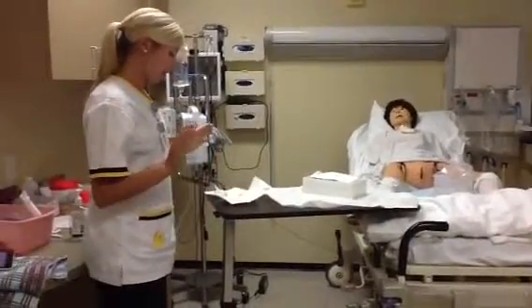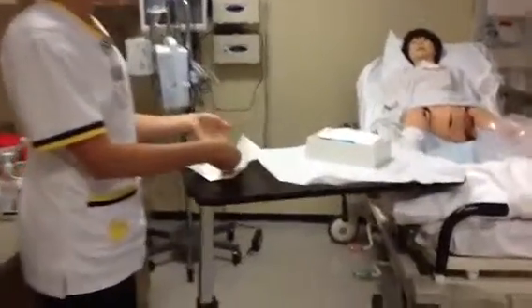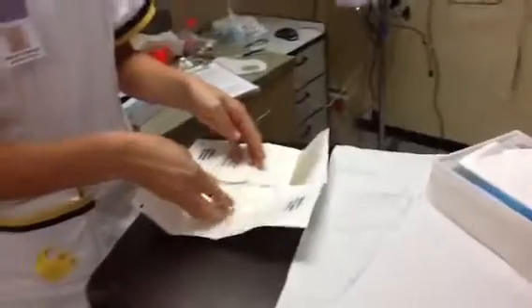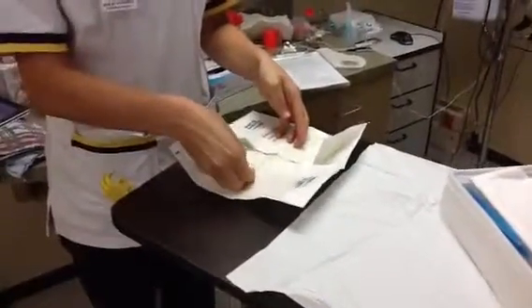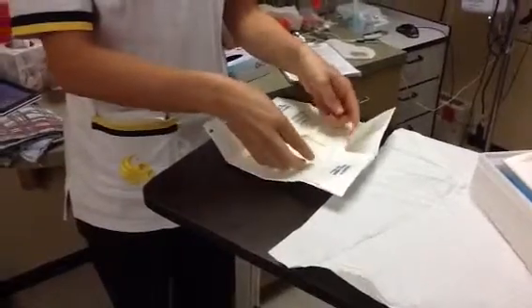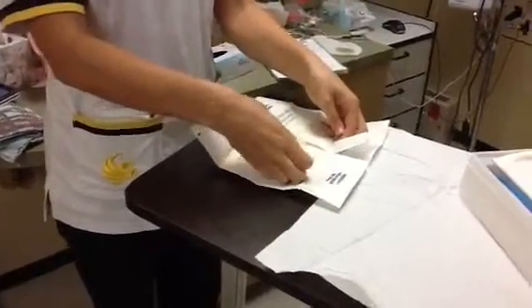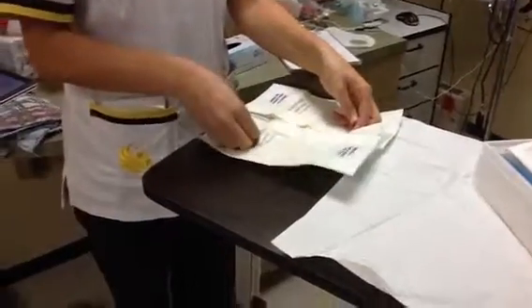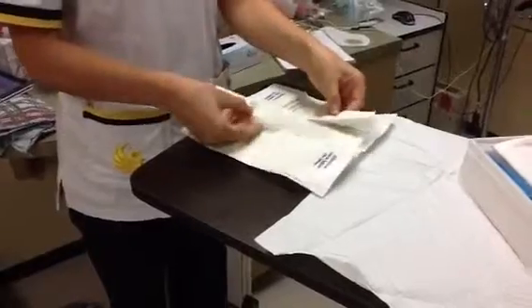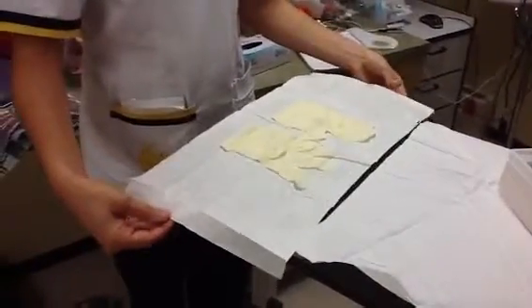To open it, I'm going to put my hands underneath because this little border is sterile, so I want to make sure I go underneath with my hands. Okay, now that I got that, I'm going to pull it open, making sure it doesn't flap back on me.